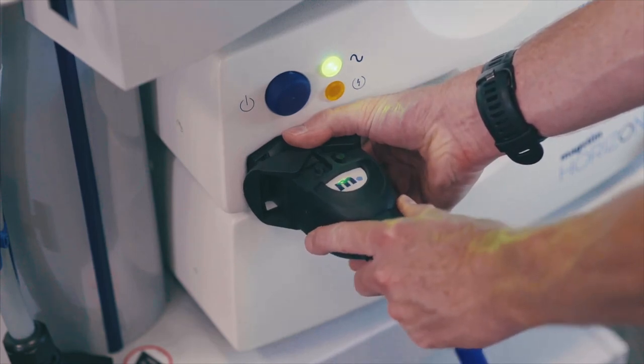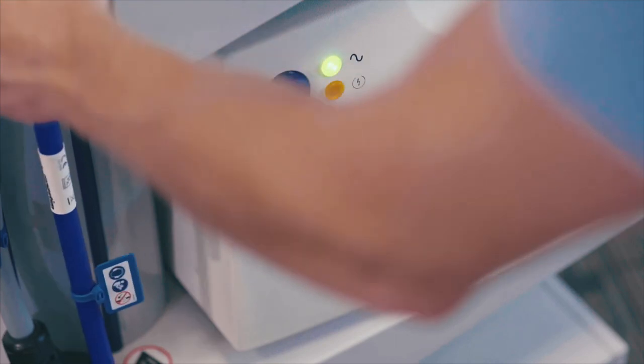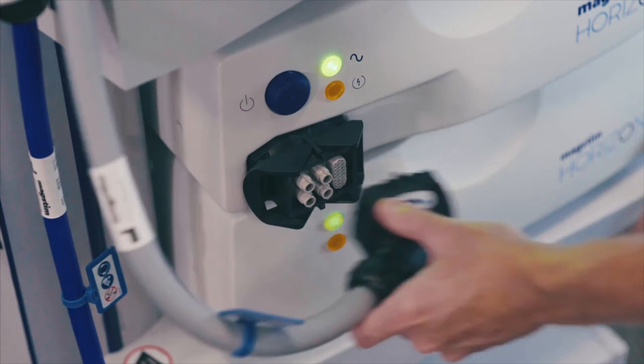Disconnect the Horizon MT coil by opening the two locking levers and removing the coil connector. Firmly insert the easy cool coil connector and secure the two locking levers.